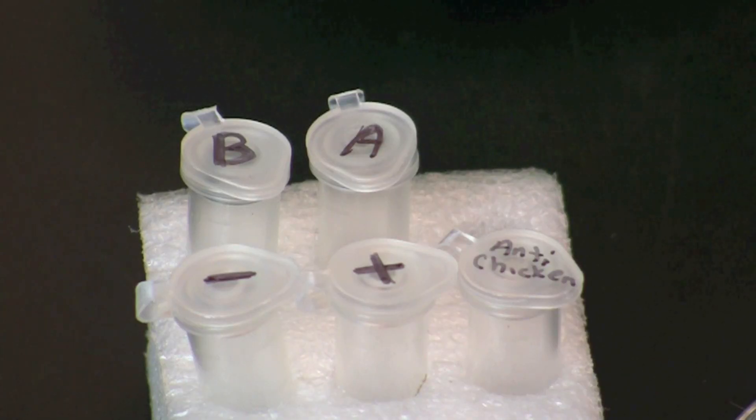For this activity we will be using 20 microliters each of test sample A, test sample B, positive control which is chicken serum, negative control which is phosphate buffered saline or PBS, and anti-chicken which contains an antibody against chicken yolk.